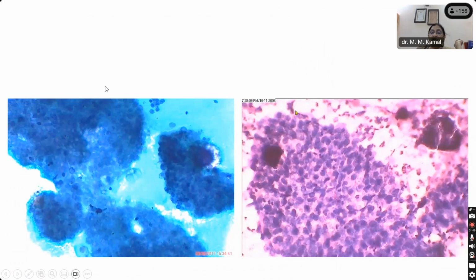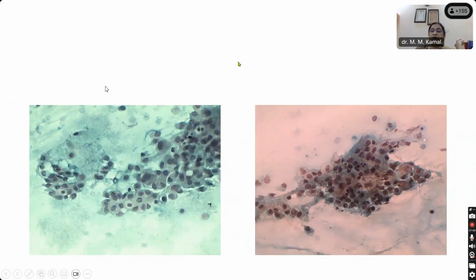Now this is an example of papillary mesothelial hyperplasia with psammoma bodies. And this is again serous adenocarcinoma. You have these malignant cells. The point here is that the diagnosis is very easy when you have the alien cells with their characteristic features. And because ovary is the commonest site which metastasizes to the omentum, that can be diagnosed very easily if it is a mucinous adenocarcinoma or a serous cystadenocarcinoma. Here all the nuclear features are seen.